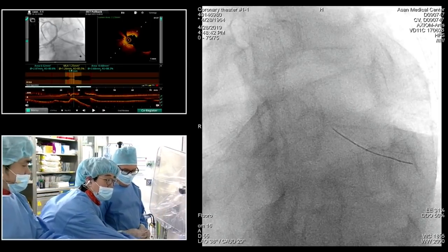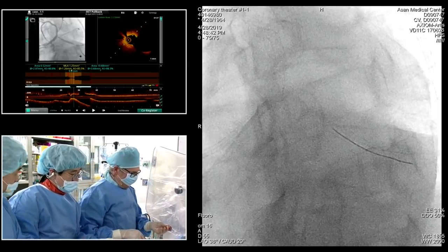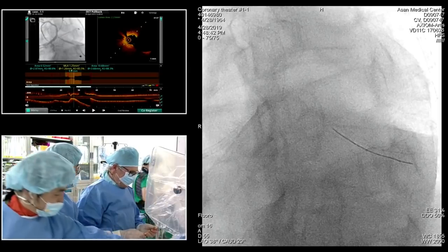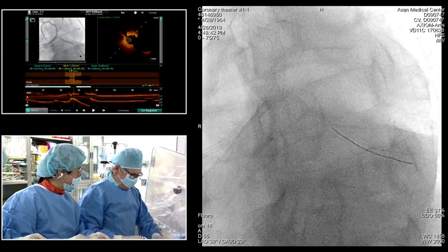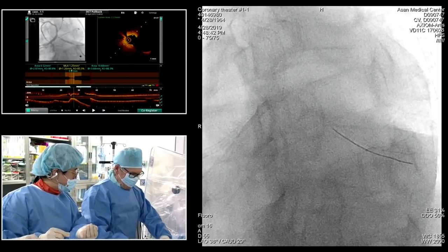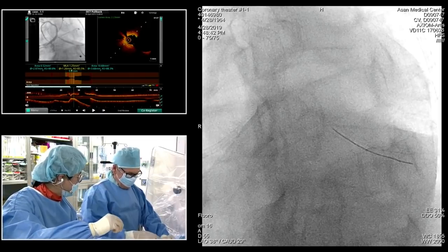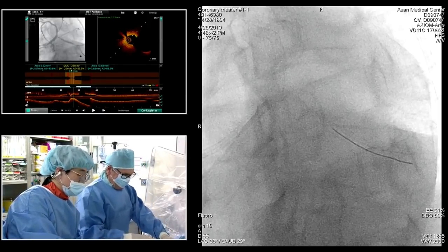restenosis is not to do angiographic follow-up. That's the only way to prevent restenosis. Yeah, but the patient was symptomatic, Antonio. This is very old data, right? In the very first data we have, we compared with a plain balloon dilation and cutting balloon before the brachytherapy.